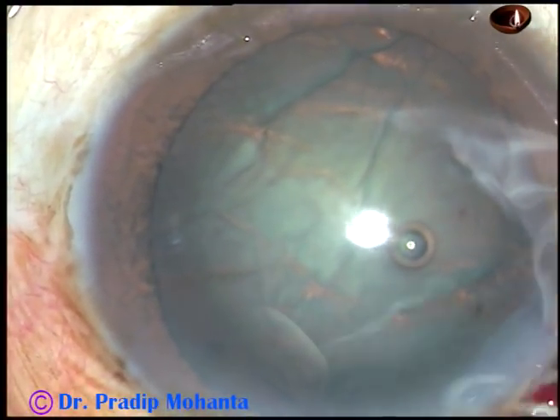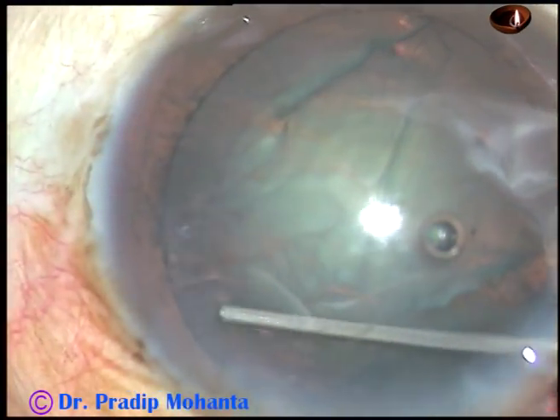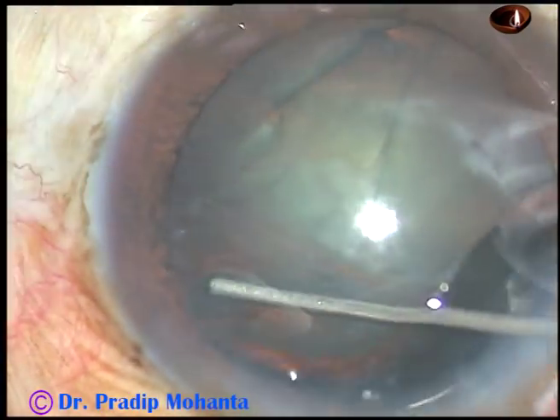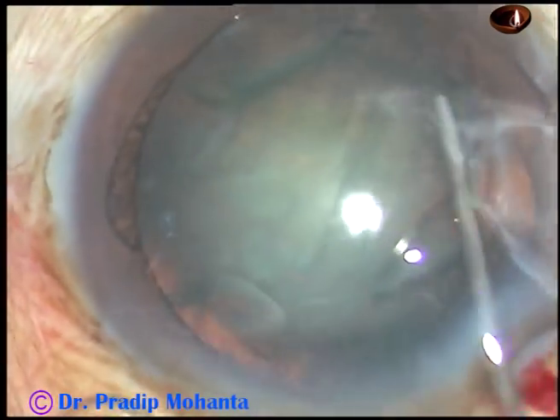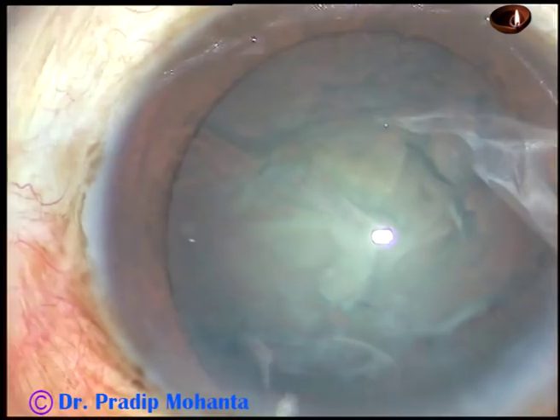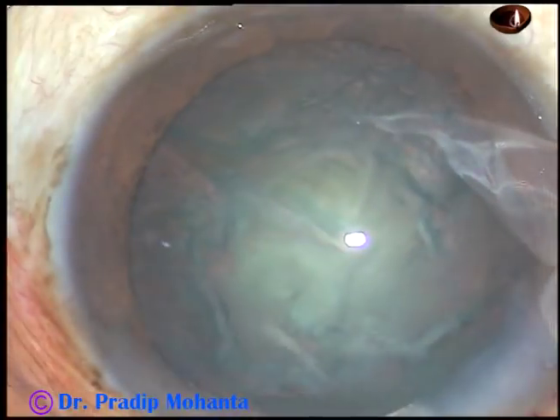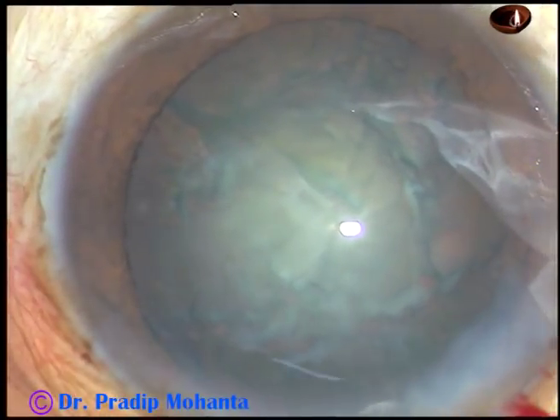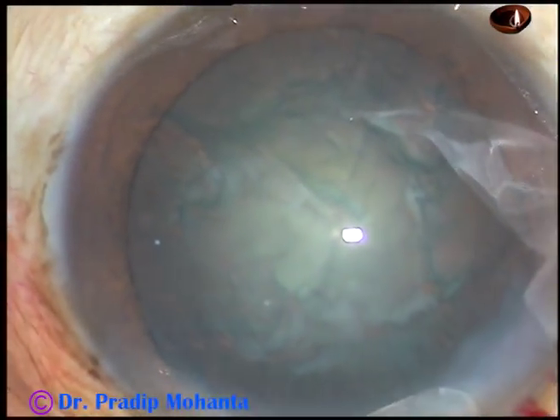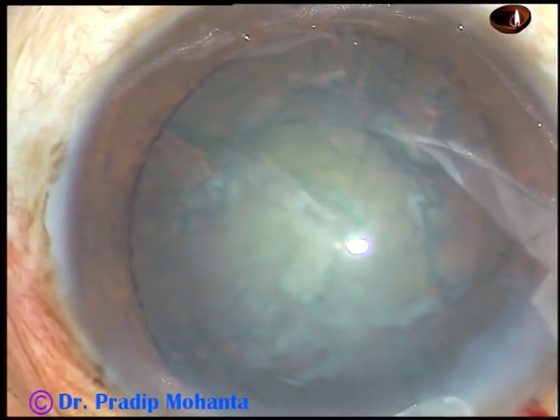So I am going to do hydrodissection now. The hydrodissection is being done and the fluid wave came to the opposite side. The nucleus is tapped and an attempt is done to rotate the nucleus. But rotating a nucleus in a case with zonular dehiscence is not easy.